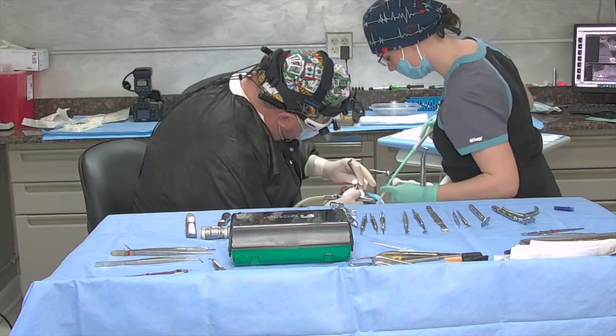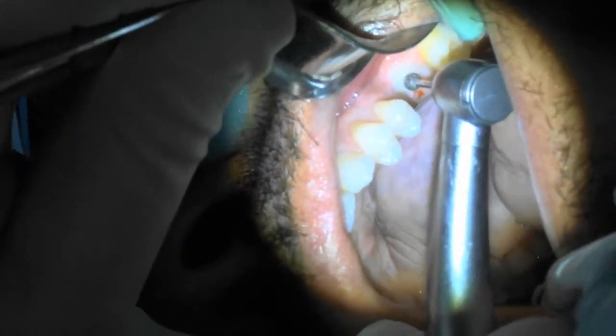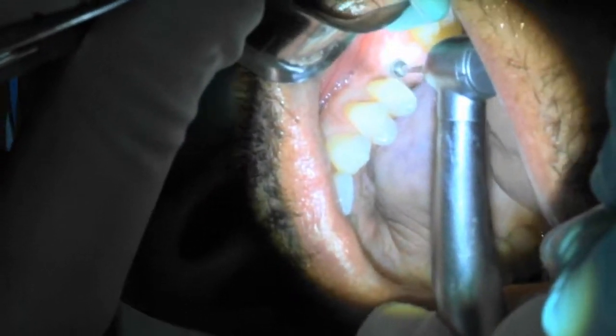Okay, so we're going to turn a little more, Matt, this way. There we go, perfect. So what I'm doing first is just notching the site.